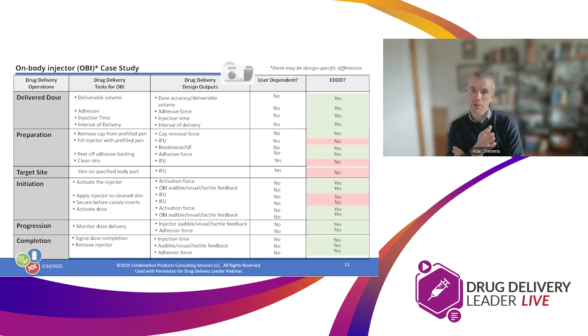From the human factors standpoint, there's a lot of other design elements involved in the design of the cap that play into whether users are going to be likely to be successful in being able to consistently remove the cap.